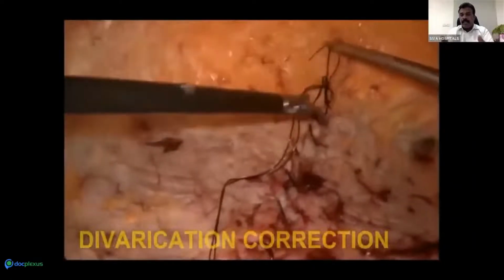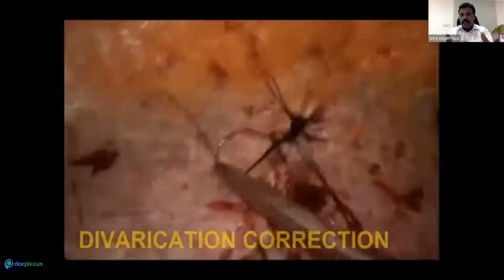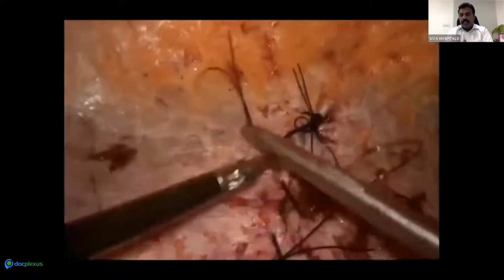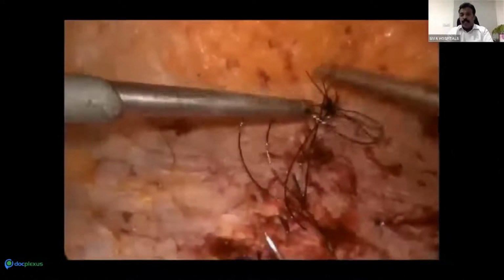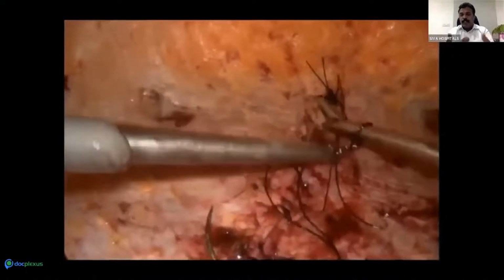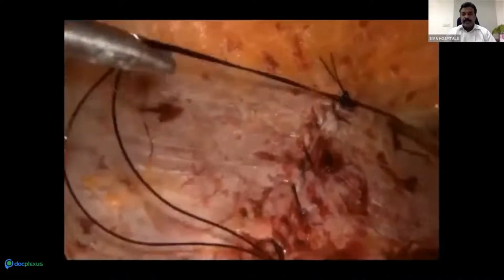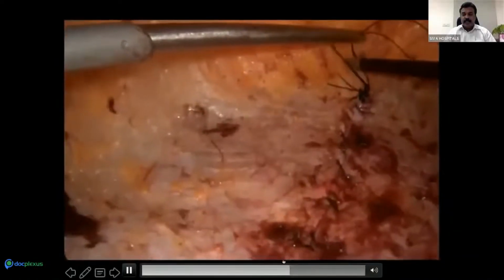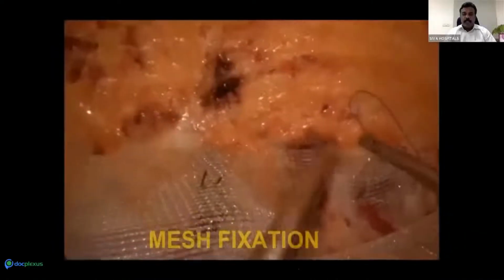You can take a 12 to 15 centimeter mesh with a length of around 30 centimeters. Depending on the patient, a 25 to 30 centimeter length mesh you can take. You put it into the tunnel and we have to start suturing. So this completes the augmentation. This is a long mesh which I am spreading over the rectus muscle.